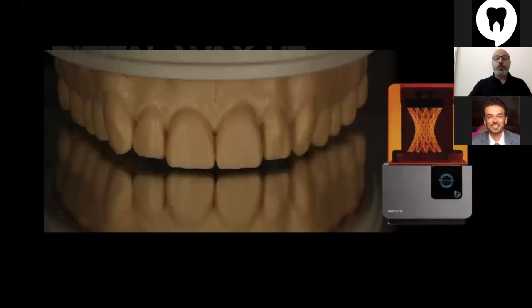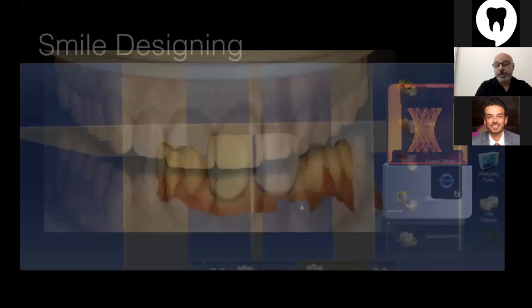So after doing the wax up, you can transfer this file into a 3D printer to get your final design on a model, and you can use this model to do some silicon stents and silicon index to make a mock-up intraoral, just to test drive your design first before going forth in your work. This is the beauty about the digital workflow. You can do anything and then transfer it intraorally later on.